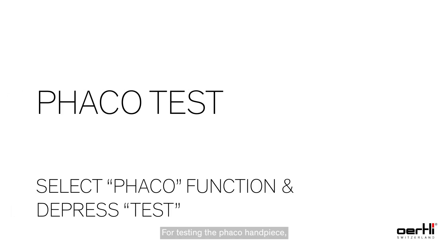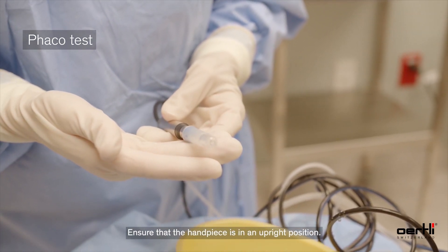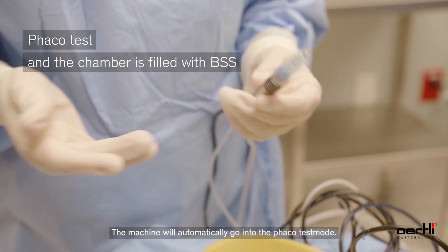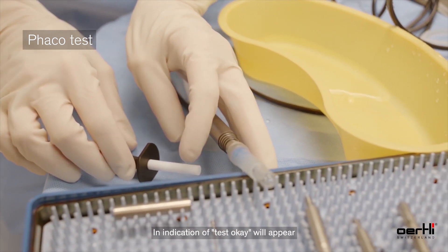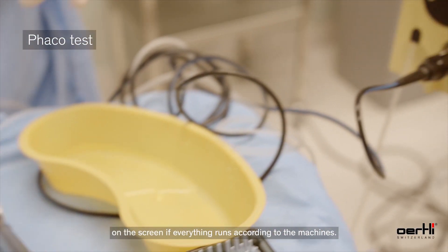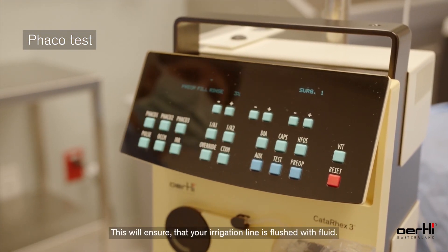For testing the phaco handpiece, ensure the test chamber is securely on the phaco handpiece and that the handpiece is in an upright position. The machine will automatically go into phaco test mode. An indication of test okay will appear on the screen if everything runs according to the machine's parameters.